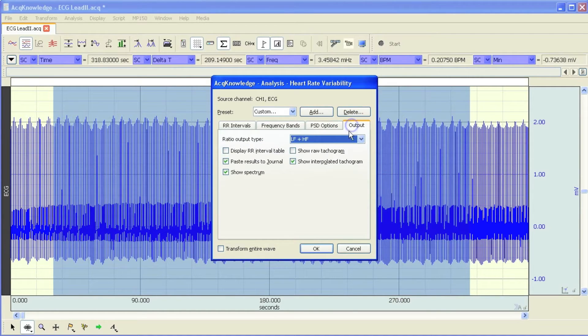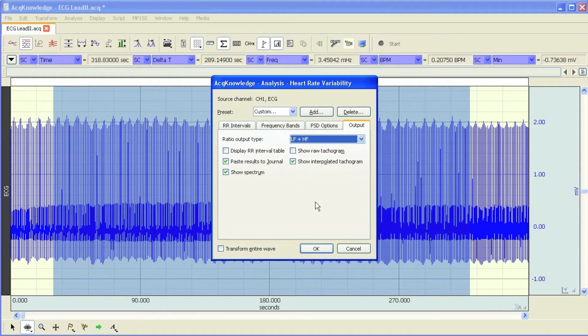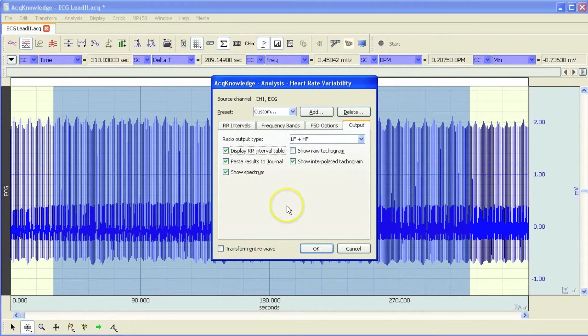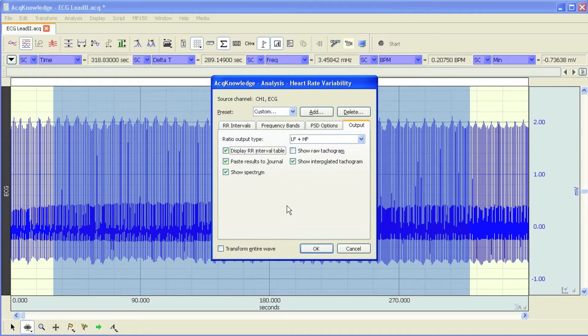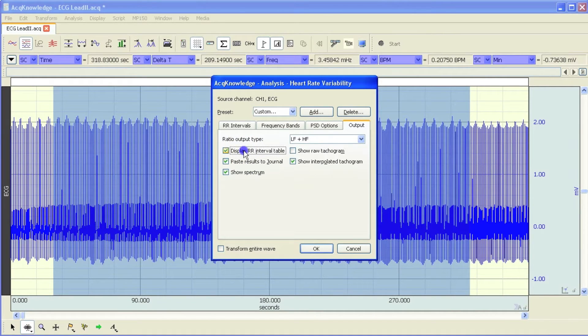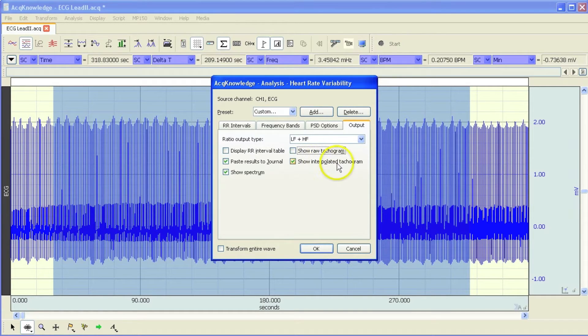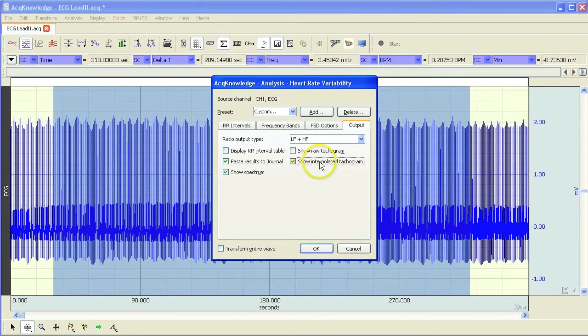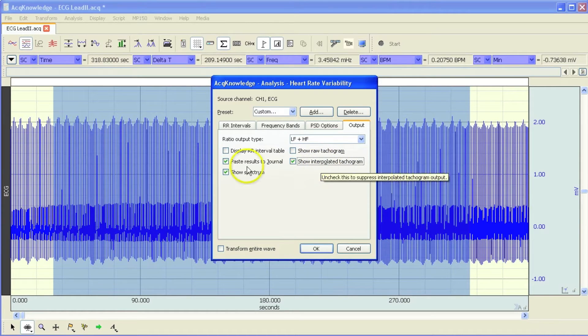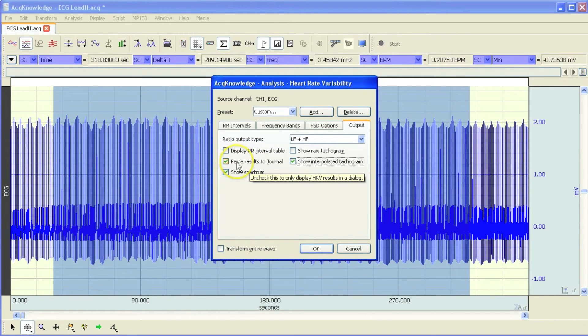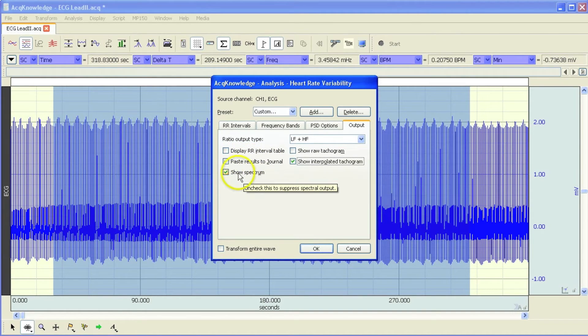Finally, the last tab allows us to control the output from the analysis routine. There are a number of options. The first one allows us to display the R2R interval numbers in a table format. So this will give you the time interval for every single R2R interval. You also have the ability to show the raw tachogram and also the interpolated tachogram. I'm going to use the interpolated one because this is the tachogram that the analysis is actually being performed on.